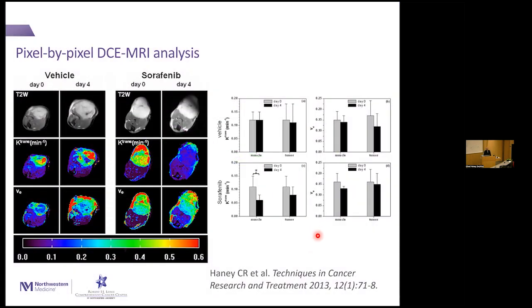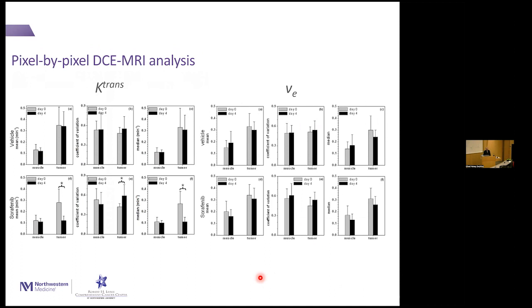So one of the things we tried was take the region of interest, say tumor, and try to fit that data after averaging it together. And it turns out that the differences get washed out and the statistics don't work. So you have to switch to something that's pixel by pixel, which means for each pixel, you're going to fit that curve, even if it has noise in it.